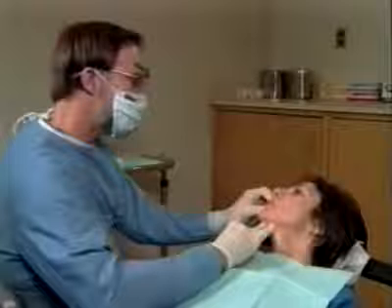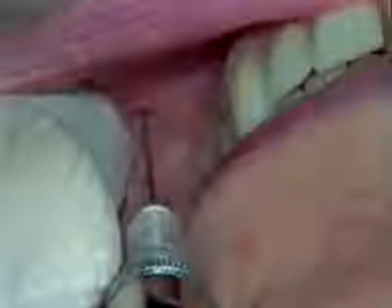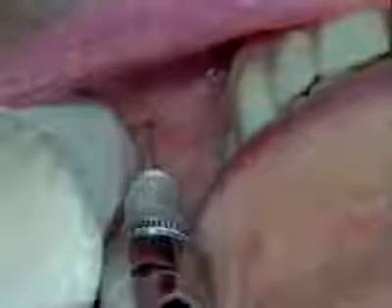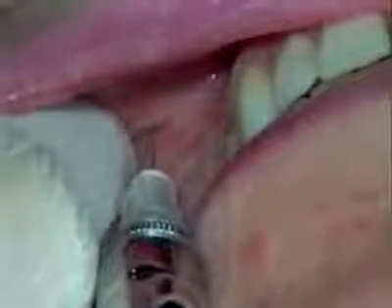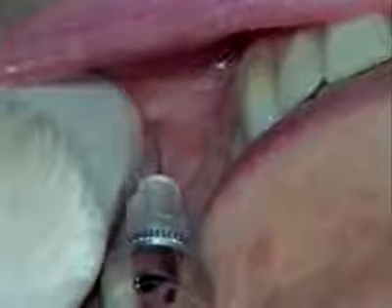For this and other injections described in this program, a few drops of anesthetic, expressed as the needle is slowly advanced, is useful to minimize discomfort. The average depth of penetration is about 15 millimeters. After negative aspiration, injection is made with the palpating finger remaining in place to help guide local anesthetic solution into the infraorbital canal. A total of 1 milliliter, or about 1/2 of a dental cartridge, is injected slowly.